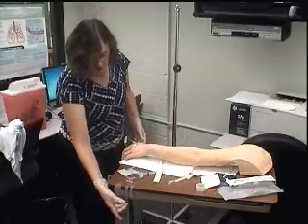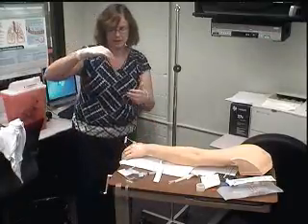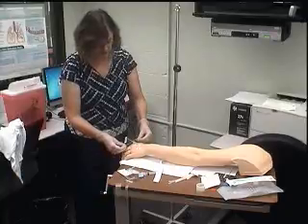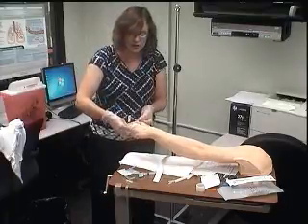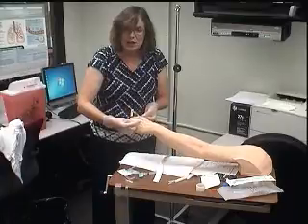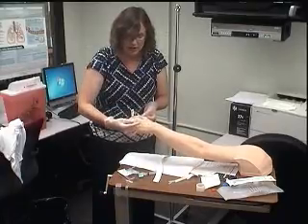But some facilities will also secure it a little bit more, like they stick a V underneath like this, so you put the tape underneath it. Now, if you do this, you do not go shoving it and disrupting that dressing. This is just to keep the catheter a little more stable. I do not try and shove this tape way under there. This dressing is secure. Do not unsecure that dressing.